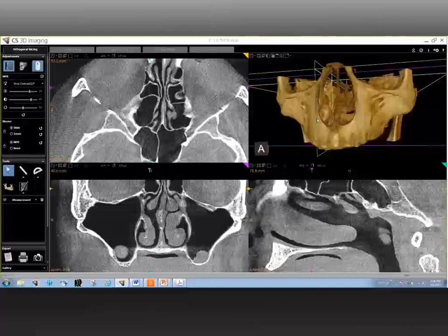Okay. Well, let me get back to what we were on, an interesting aside that we got on, and I do think it's important to point out not just the benefits of cone beam CT, but as we have mentioned here, some of the limitations. But let's go back into the subject, and let me ask you another question. What are the most important landmarks to be considered while planning for implant surgery in the maxillary jaw?